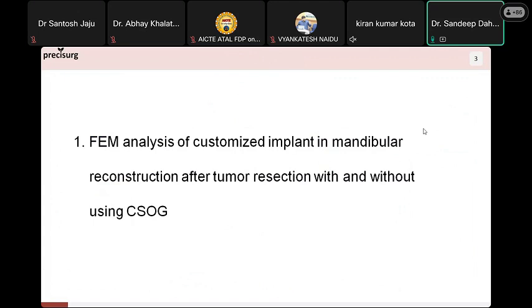When compared to the area of the other 3 cases, in case 2 and case 3 the fixation surface is low as compared to case 1. Also, due to the increased fixation surface area in case 1, all the screws were properly fitted in case 1, which is not so in the other 3 cases. What happened because of that?